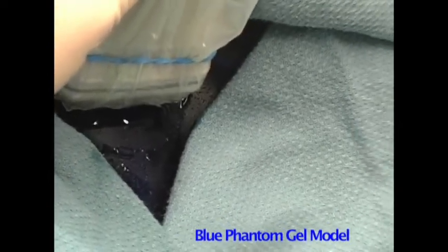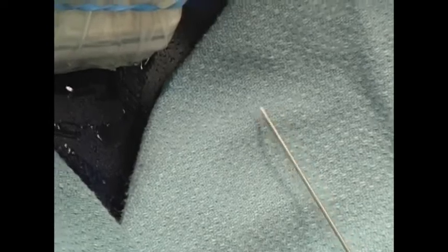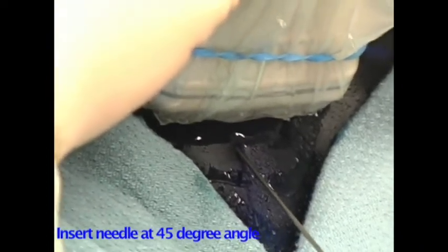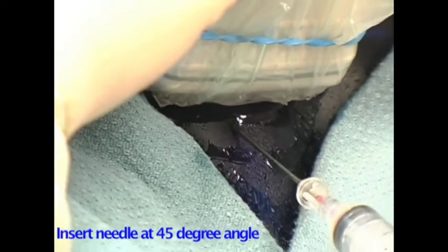With the vein directly in the center of the transducer, the needle is inserted along the same path as our anesthetic with the bevel pointed inferiorly. It's inserted approximately 1 centimeter above the transducer. The transducer is angled towards the needle tip so that it's visualized just after it enters the skin.